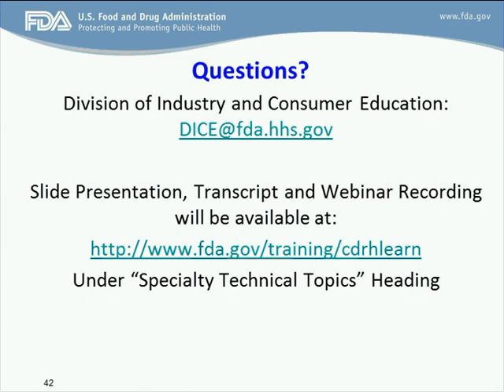Hi, this is Steve Elliott. Currently, there are no established levels for hydrogen peroxide residuals. Concerns associated with hydrogen peroxide should be addressed through material compatibility of the device and biocompatibility. So that would largely be device specific to provide that information. To my knowledge, that specific ISO standard doesn't contain any information along those lines either. Okay, great.